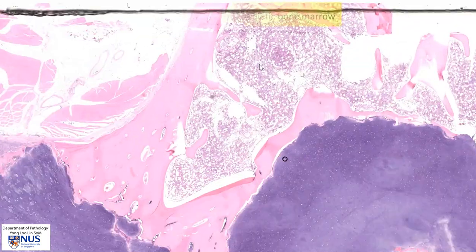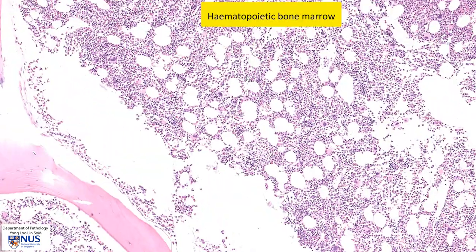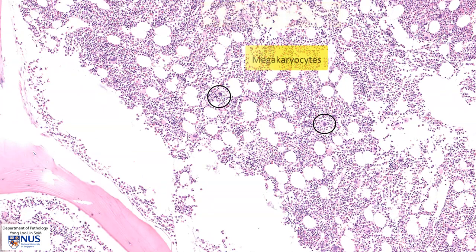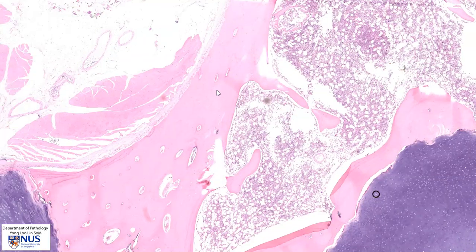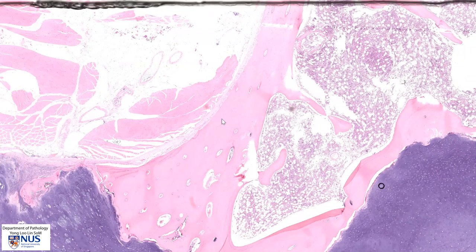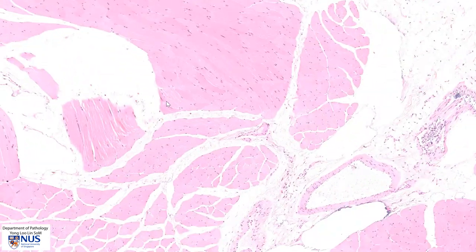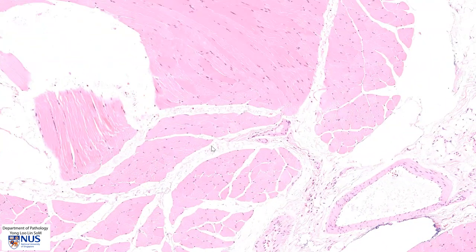There is a little bit of bone marrow here and there is ongoing hematopoiesis. These large cells with quite abundant cytoplasm and large nuclei are megakaryocytes. This is the bony cortex and this is the periosteum, and this is the surrounding skeletal muscle as well as adipose tissue.